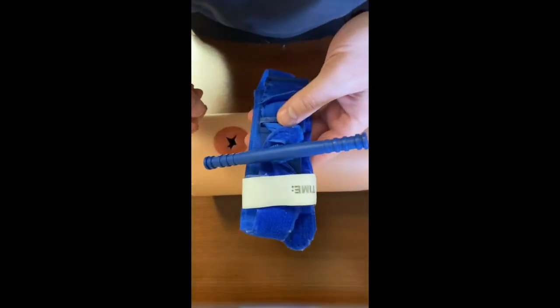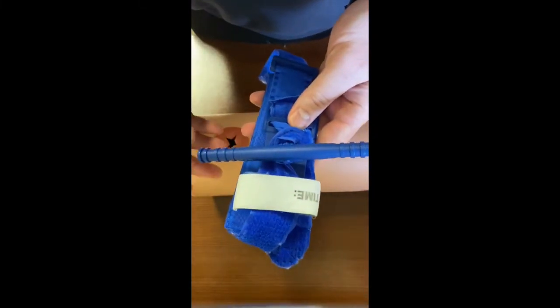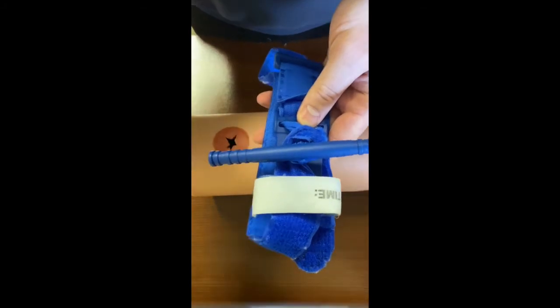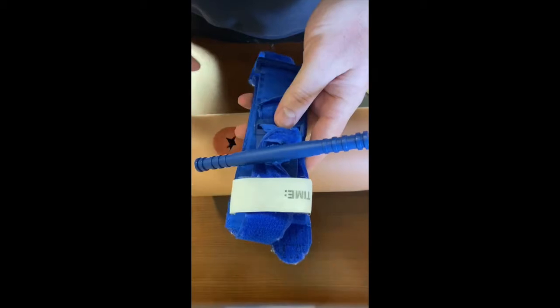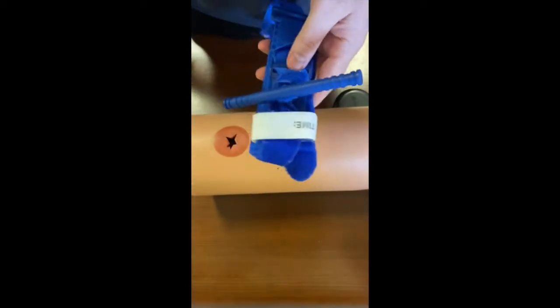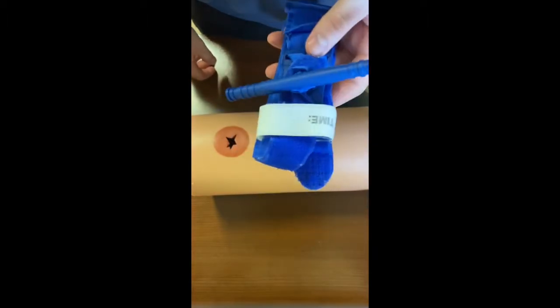A little background on the tourniquet. Right here is a CAT tourniquet, one of the popular manufacturers. Right here we have the windlass, which is what we're going to use to make sure we have a nice tight tourniquet on. And right here we have the time marker and final band that we're going to mark the time so the doctors at the hospital know how long it's been on.